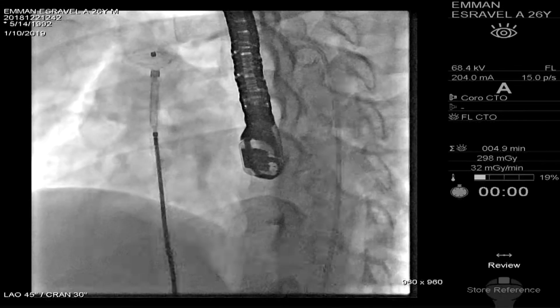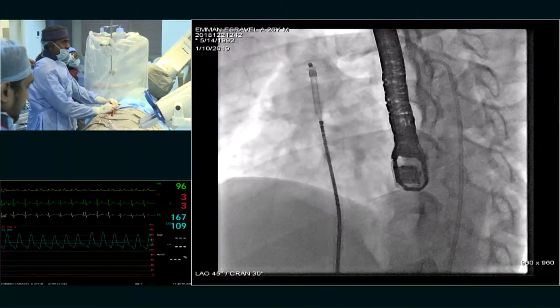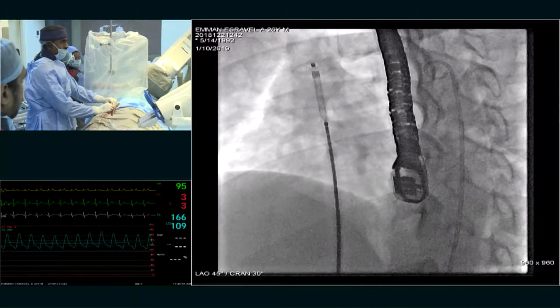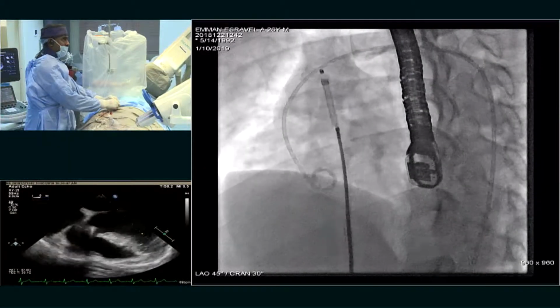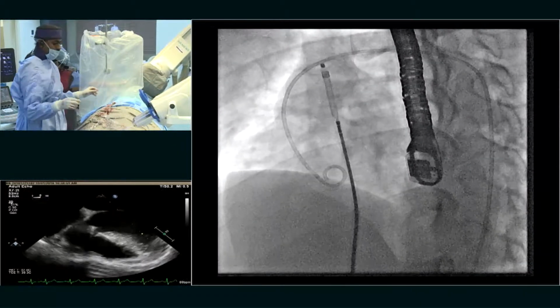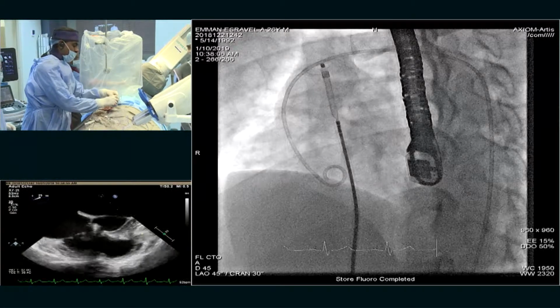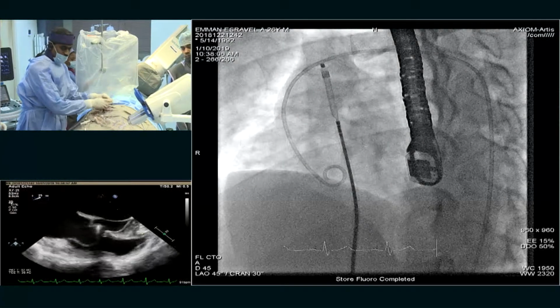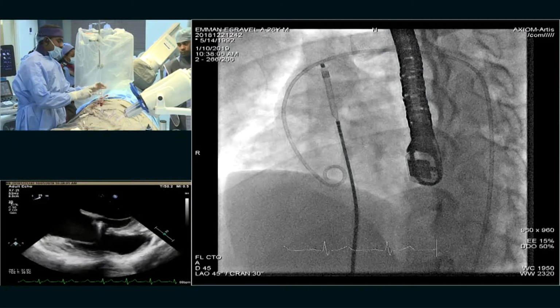So this is going to be the device. This is the left ventricular end of the device. Now, in order to get a landmark about where the aortic valve is, I am going to keep the pigtail here so that I will notice when I am coming below the pigtail. I will also have pressure guidance from the aorta when I am falling into the left ventricle and the right ventricle. So I will flush the side arm of the sheath now.